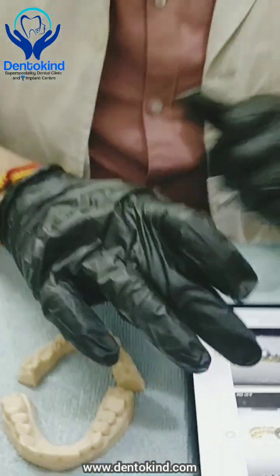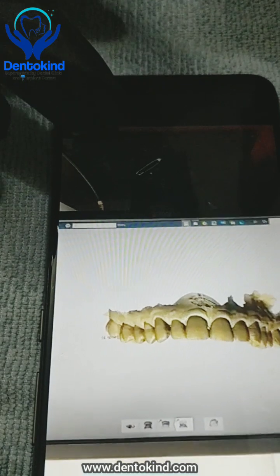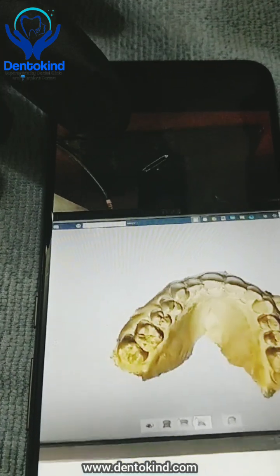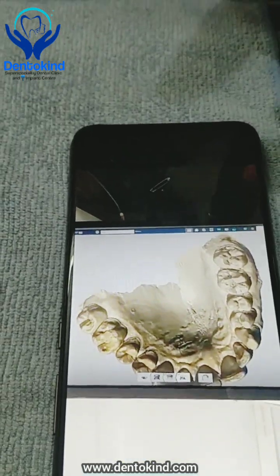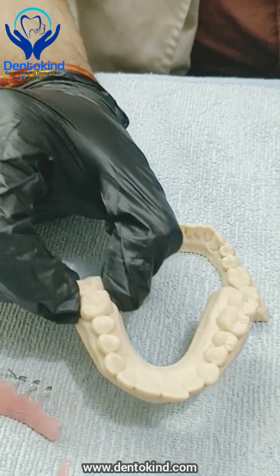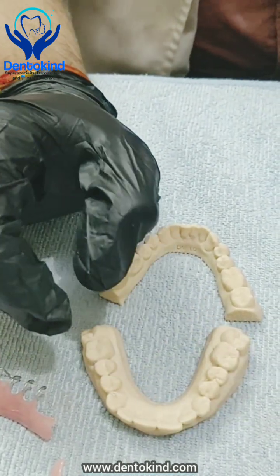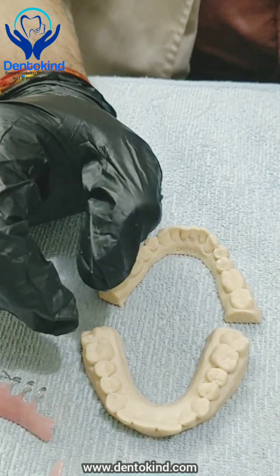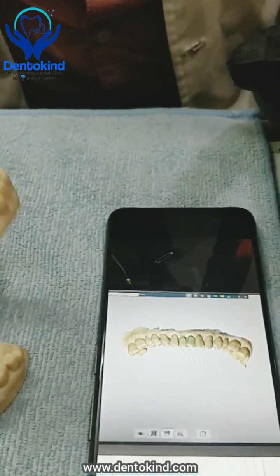So let me show you the case. My patient sent me a 3D scan and we have printed this cast. This is the upper scan they sent us and this is the lower scan they sent us.